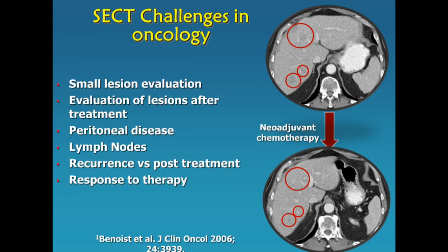In oncology patients, these challenges are further amplified because of a lot of other complexity that exists in these patients. For example, the liver is a common site for metastasis for various gastrointestinal primary tumors. And after treatment, these metastases are difficult to detect because of their native density, but also the background liver changes in its attenuation due to steatosis, making the detection even more difficult.